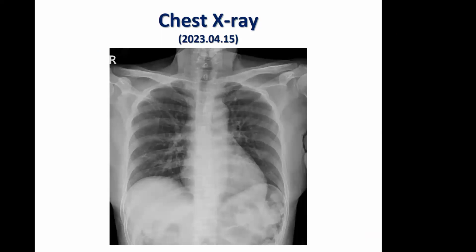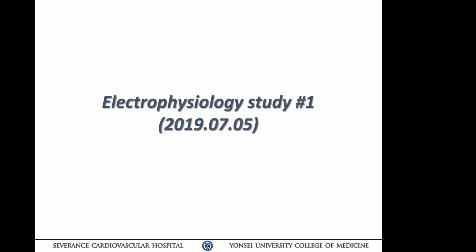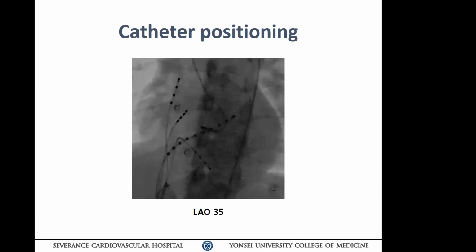환자 Chest X-ray, okay. 체스트 엑스레이에서는 카디오메갈리는 관측되지 않았고, EP study를 처음에 de novo로 수행한 EP study를 해봤습니다. 카테터 포지션은 진행하고 나서 촬영이 된 거라서 RT 어프로치까지 들어가 확인이 되긴 했는데, 처음에 듀오데카폴라 카테터가 CS에 잘 진입이 안 돼서 데카폴라 카테터를 CS에 사용을 했었고, 네, 옛날 그림입니다. 2019년도 de novo.